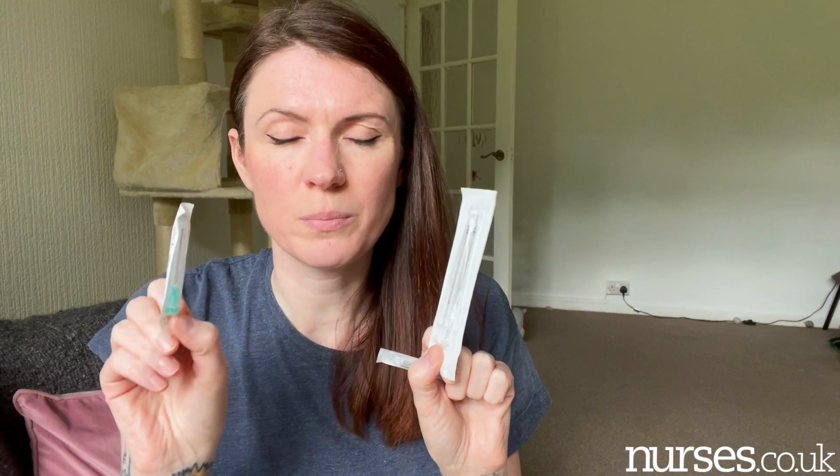So you draw up, and it's again infection control, safety, that sort of thing. We always draw up the liquid with a green needle, or a red blunt fill needle, which is normally a red coloured needle. It's a blunt needle, and that stops the glass particles from going back up into the syringe if you've got a glass bottle. So they're really good to use as well. But I always draw up with green, and then normally give with blue.